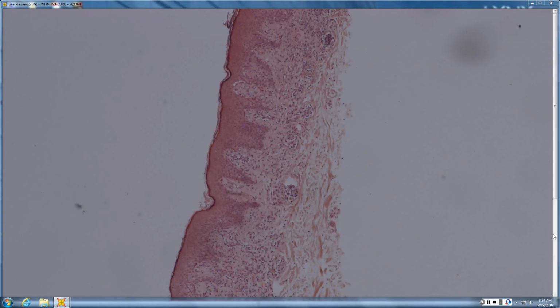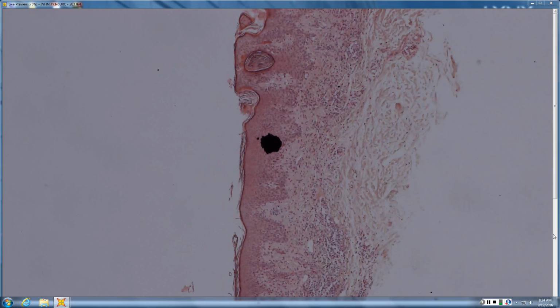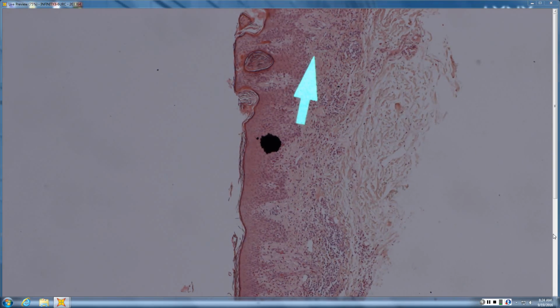This looks like more of a vacuolar pattern. So it looks more of a vacuolar pattern. Tell me about your corneum. Acute there. Yeah, pretty basket weave. Tell me about your papillary dermis. Why is it so wide and so red and so ropey? Looks like there's some fibrosis. Yeah. Some papillary dermal fibrosis. Papillary dermal fibrosis with a basket weave horn? So fixed drug. It's a fixed drug, and then that would suggest that all of these red things probably are not erythrocytes. They're probably eosinophils. Look for some deep pigment around the vessel.